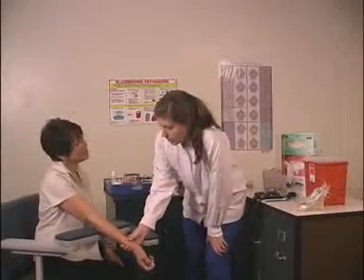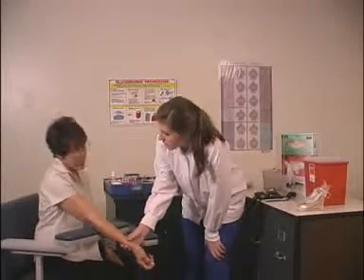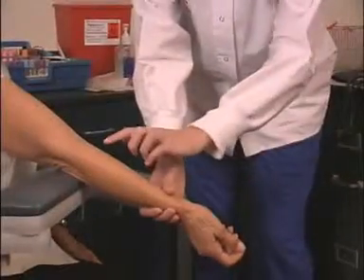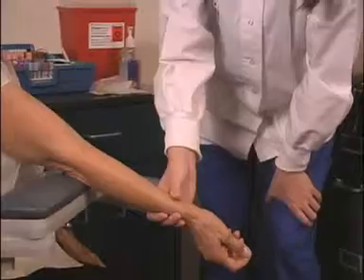When was the last time you had aspirin or any similar medicines? I think it's been about a month. Okay, and this test might leave a little bit of a scar right about there. Is that okay? It's okay.